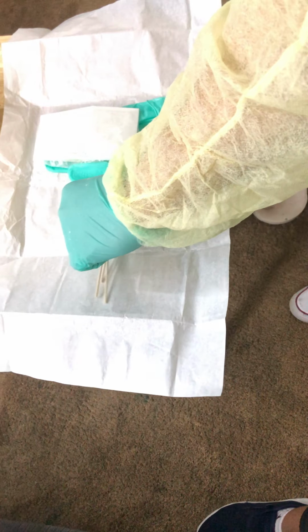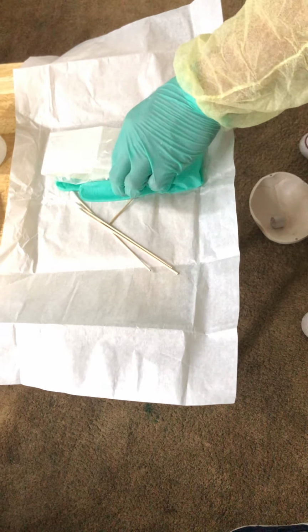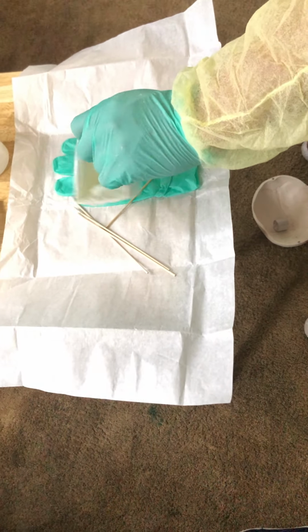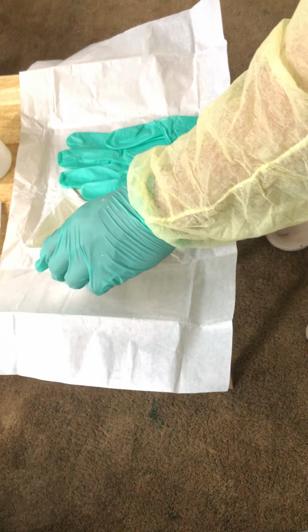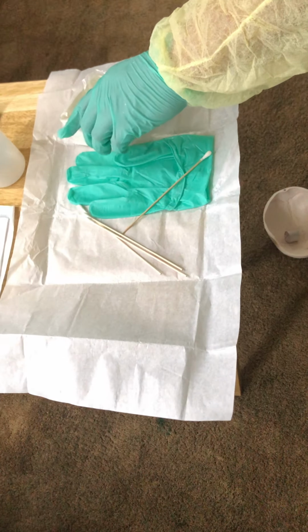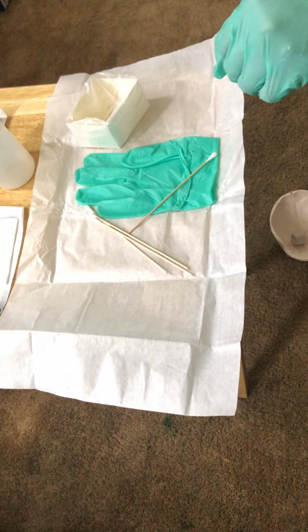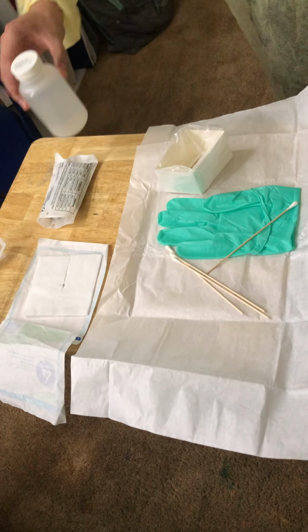As you can see, only 3 of them are within the sterile field. It's fine, because I only need 3. Make sure I don't cross my sterile field. This is sterile to sterile, so I could freely move this around. I want to move it right here within my sterile field. And with my non-sterile hand, pour my saline.